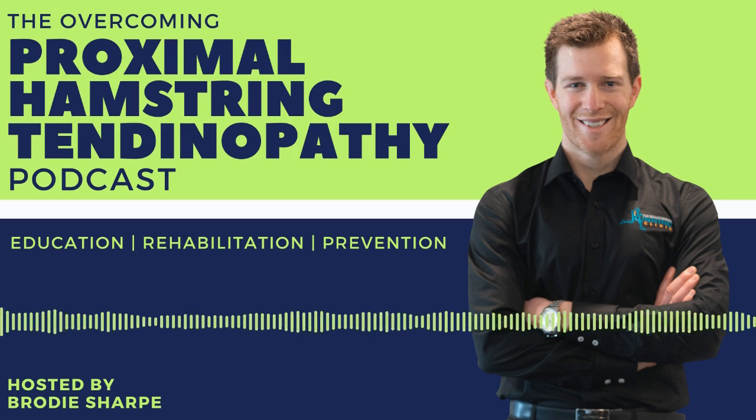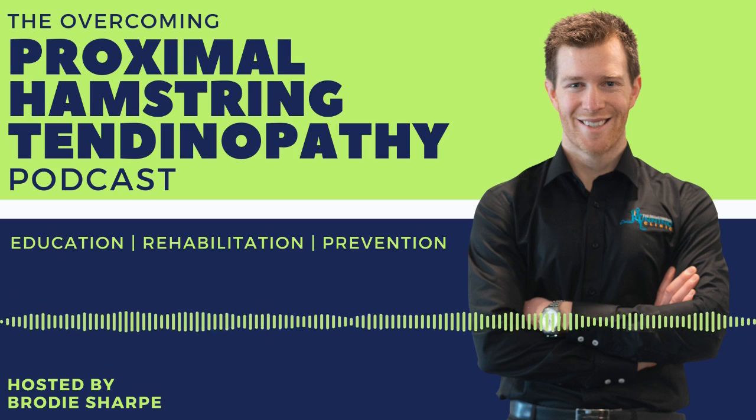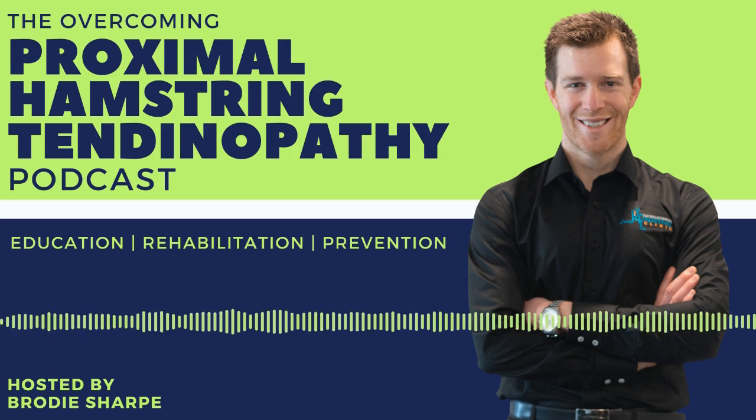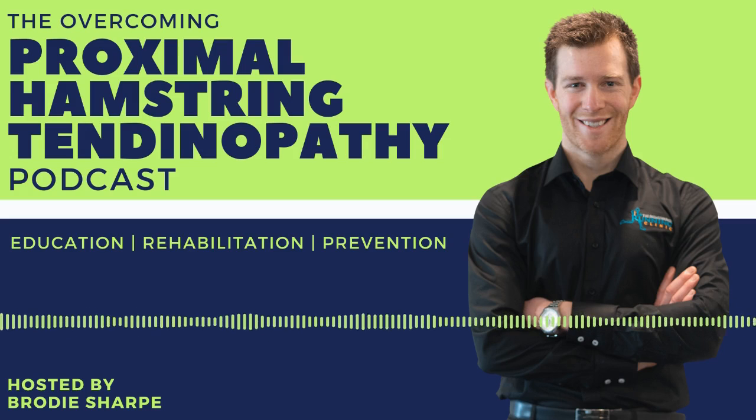And if a patient has not responded in that 5 or 6, in my opinion, you're wasting your time with Shockwave. So if a patient is not responding, that might be a good point to raise here. If a patient is not responding to Shockwave, it's usually because of 3 reasons. One is the diagnosis is not right. A typical example would be, I've seen a lot of runners with plantar fasciitis have Shockwave not improving because they have calcaneal bone stress reaction. It's a bone marrow edema. It's not plantar fasciitis. They're having a lot of swelling, because you see that in ultramarathon. So if things are not improving, it might be useful to get a diagnosis.